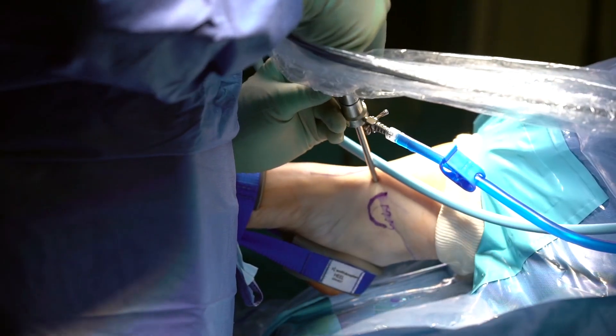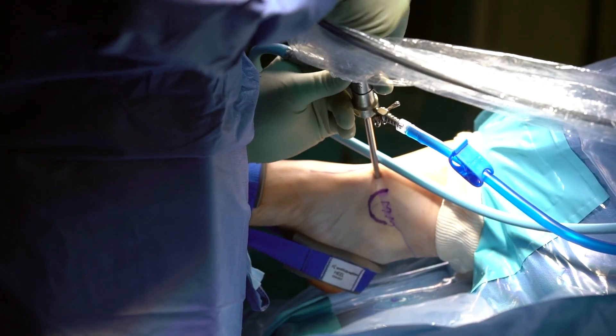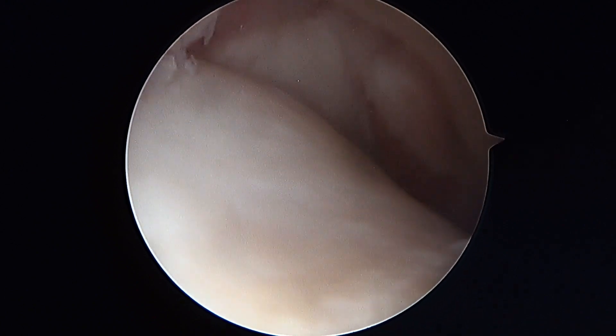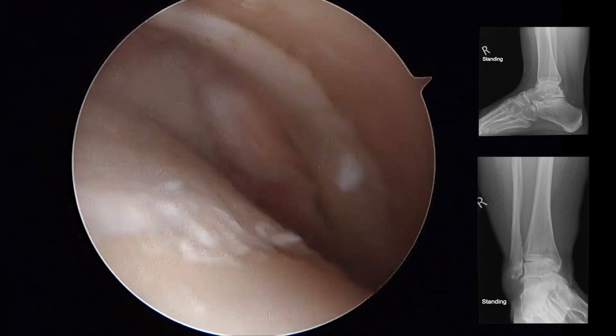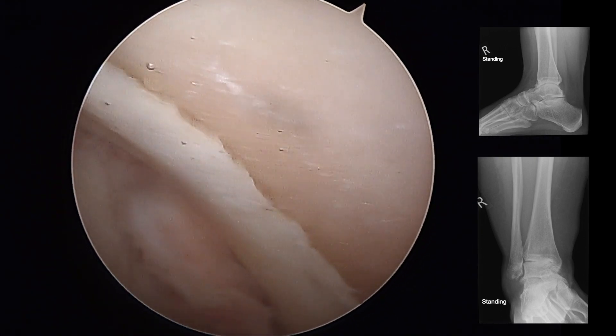The arthroscopic instrumentation and camera are inserted and the joint is visualized. The lateral aspect shows intact cartilage, and moving to the medial side there is complete loss of cartilage on both the talar and tibial sides.